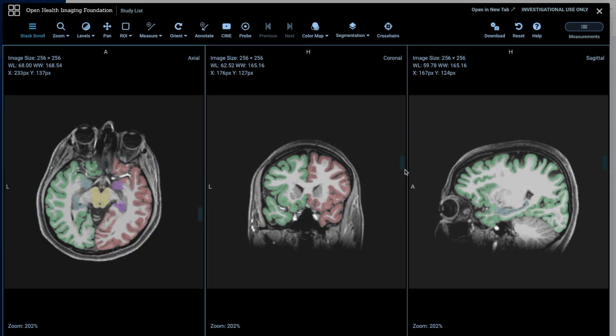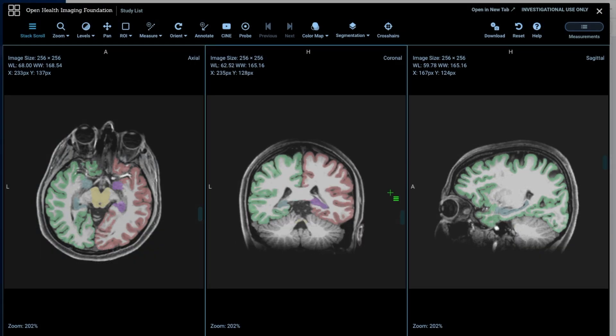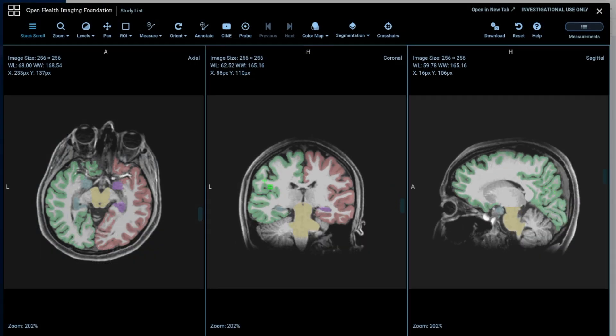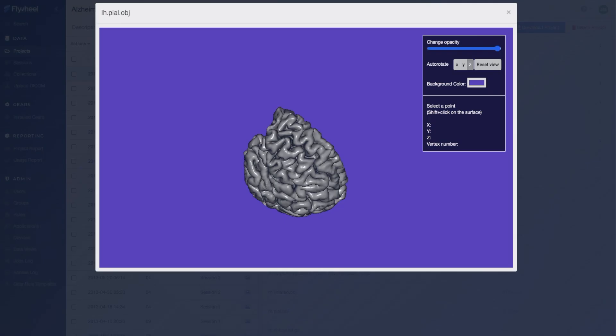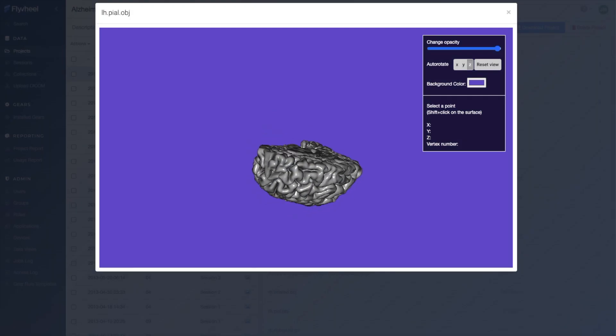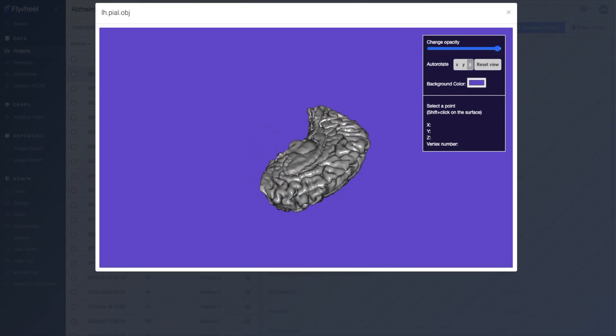Our easy-to-use interface with support for multiple types of viewers allows you to quickly view images, analyses, reports, and other data across your projects.